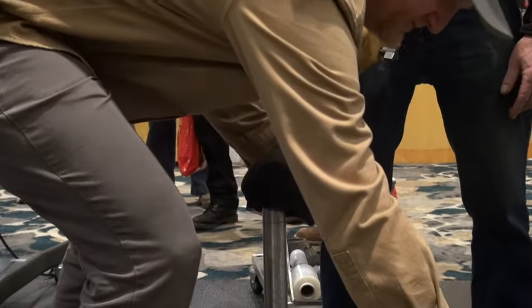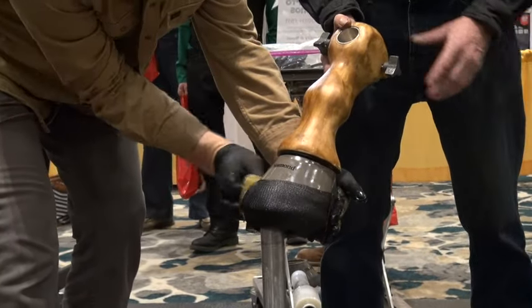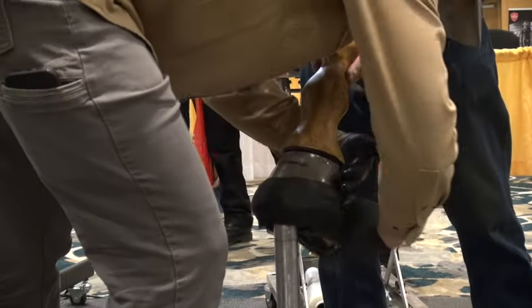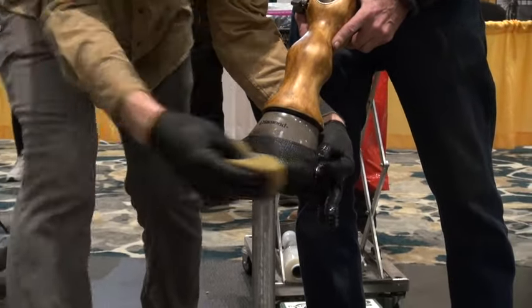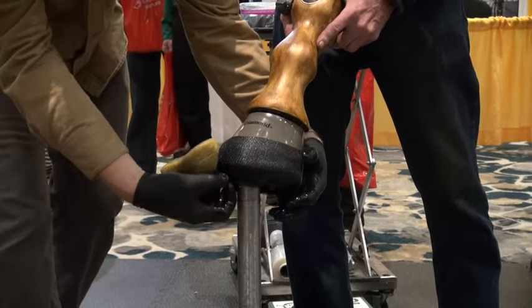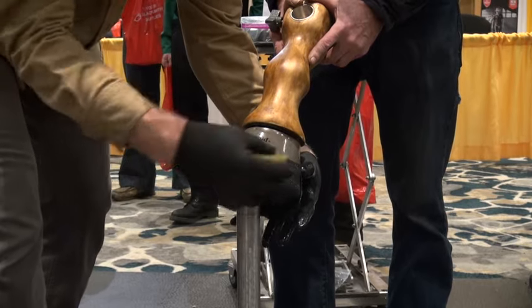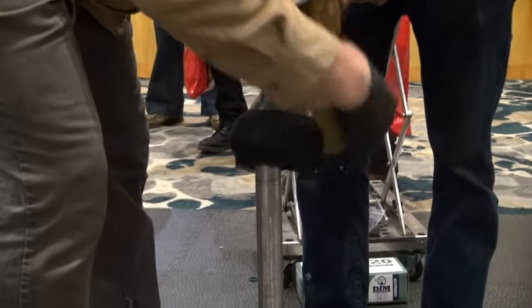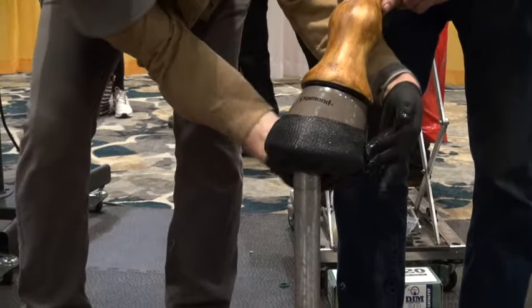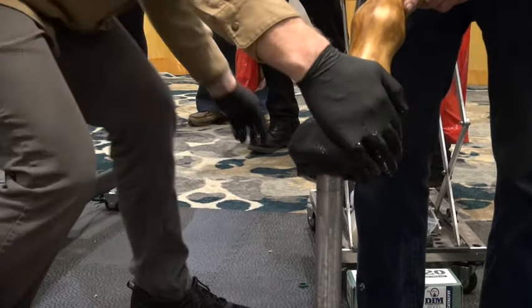So then I just go in. The water is going to activate it, so I'll just go in with a sponge and wet the casting material. You see it's all irregular on the bottom — I'm not going to worry about that because I'm going to put the foot down and the floor is going to actually mold that bottom to the same as the bottom of the horse's foot and it's going to keep everything flat. I don't worry about that. The weight bearing is going to take care of that itself.